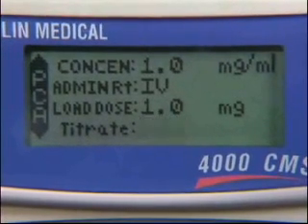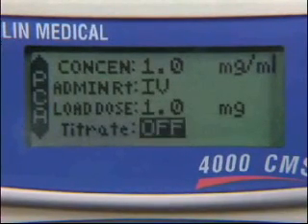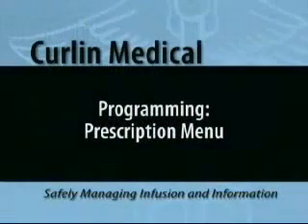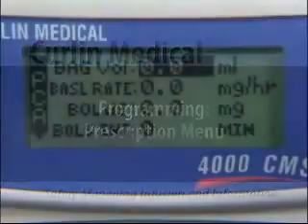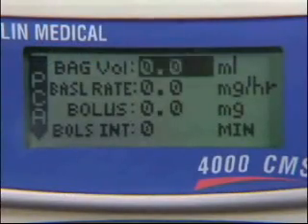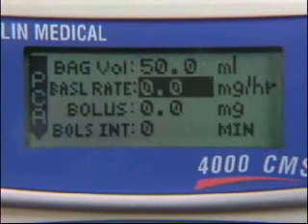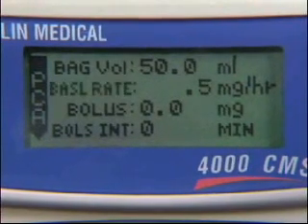The titrate feature allows maximum and minimum amounts of medication to be programmed as a safety measure. Press the Yes Enter button to confirm off and advance. Press the Yes Enter button to confirm and advance to the prescription menu. Use the number keys to enter the bag volume and press the Yes Enter button to confirm and advance. Use the number keys to enter a basal rate, or leave the number at zero if there is no continuous rate. Press the Yes Enter button to confirm and advance.